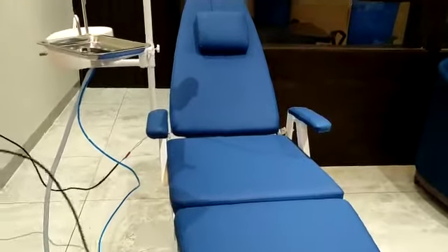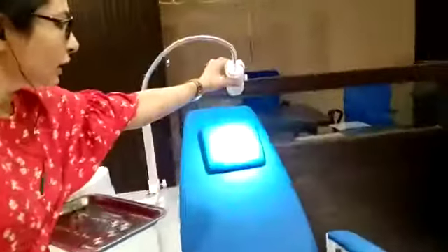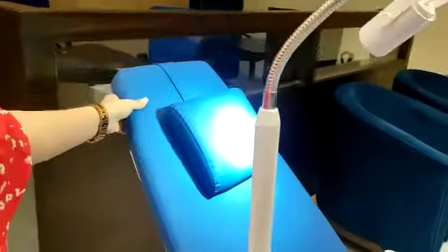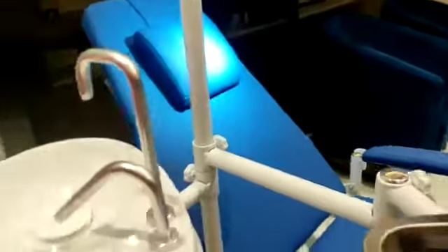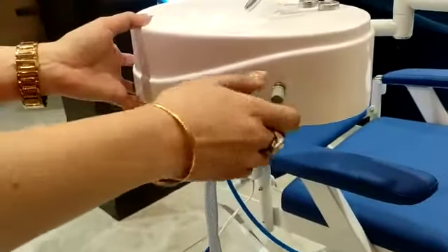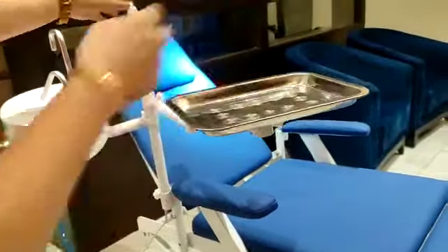Presenting to you Dentmax new dental portable chair. This is the portable dental chair with LED headlight and a portable flexible backrest. This is the spittoon with knobs for the water, and this is the utility tray.